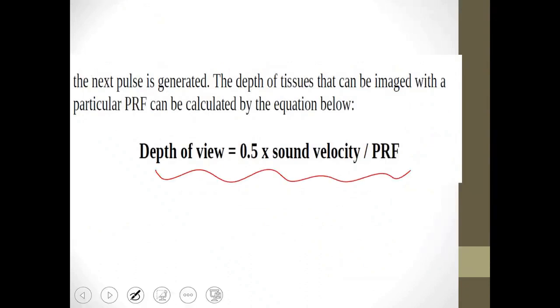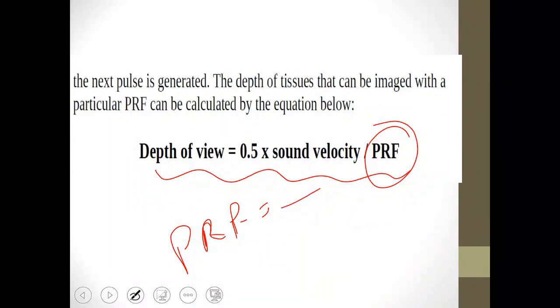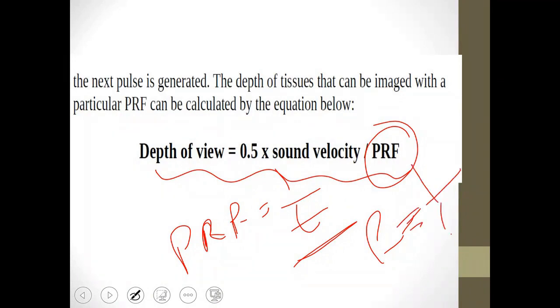This is the equation for the pulse repetition frequency. If I have a unit of frequency, the same idea applies: if you have, for example, one pulse or one frame, then there is a relationship between it and time, the time of reception. This relationship is crucial in understanding how frequency and time interact in various scientific and practical applications.